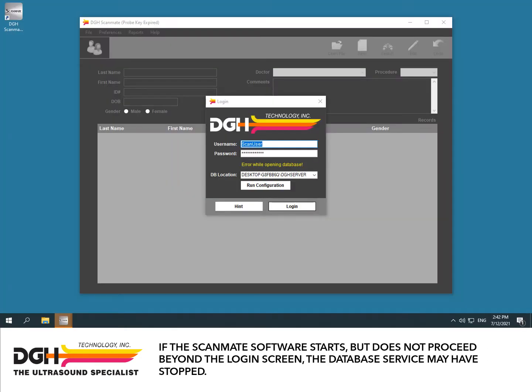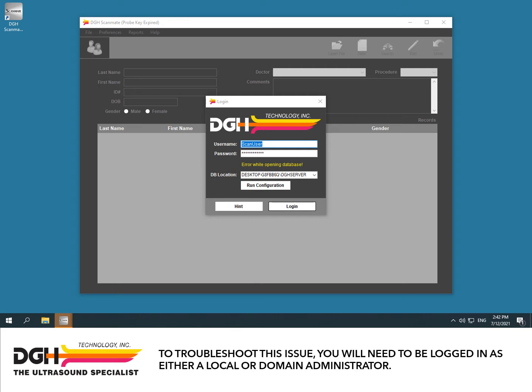If the Scanmate software starts but does not proceed beyond the login screen, the database service may have stopped. To troubleshoot this issue, you will need to be logged in as either a local or domain administrator.